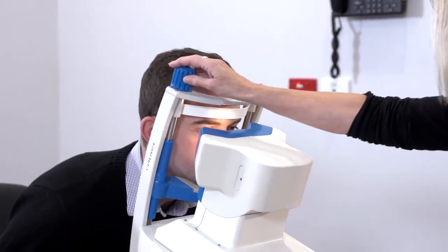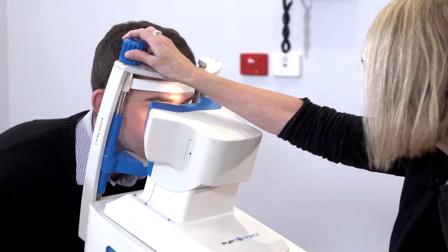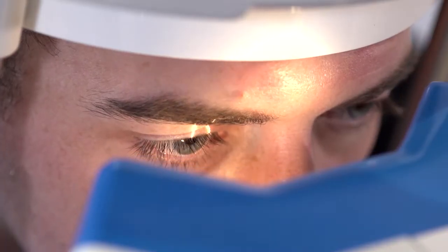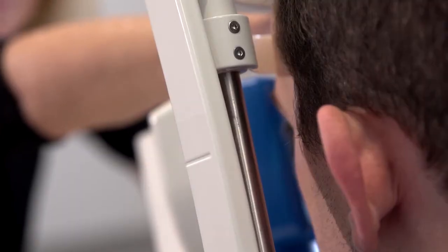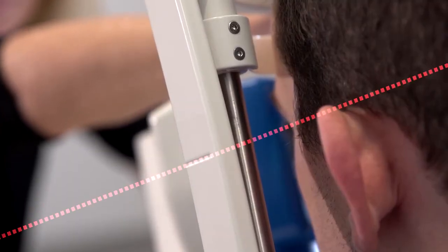After answering the patient information questions, you will be prompted to align the patient's eye on the eyeConnect device. Use the knob to adjust the chin rest height so that the lateral canthus of the patient's eye aligns with the groove on the chin rest upright.